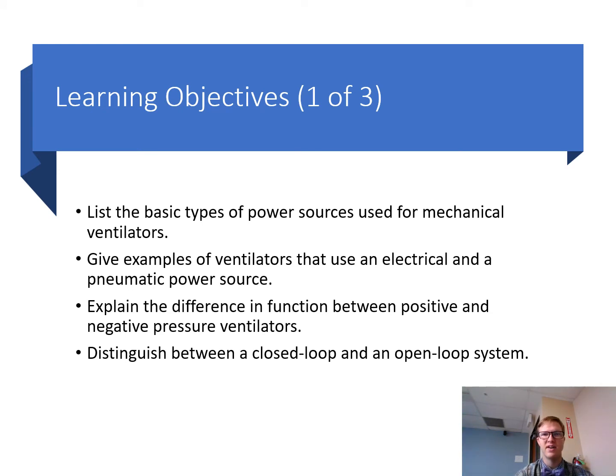All right, so basic early learning objectives. When we're looking at ventilators in the clinical setting, they started to develop back in the 1950s and 1960s for post-op ventilators. They used to use the Emerson, right? If you want to look up a picture of that, they were usually used post-operatively in the 1950s and 60s. They're classified based upon their ability to deliver the breath. And now we have technological advances, even during the past 50 years, that have dramatically changed the way these machines operate. And these changes required an update to how ventilators were classified.